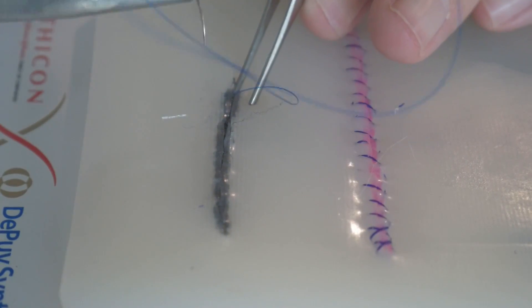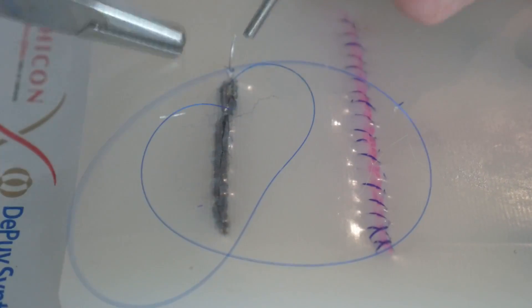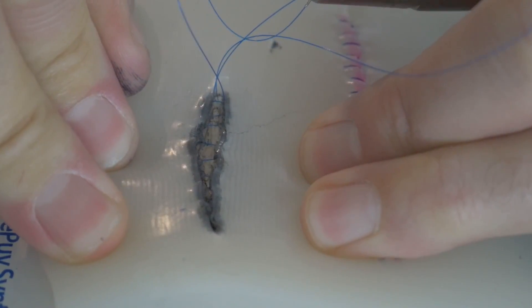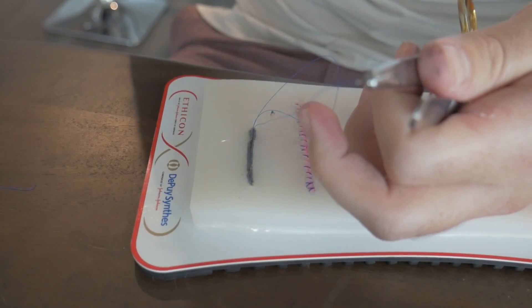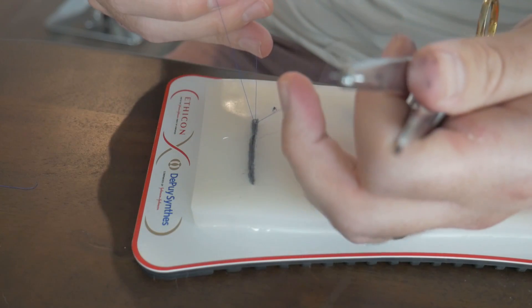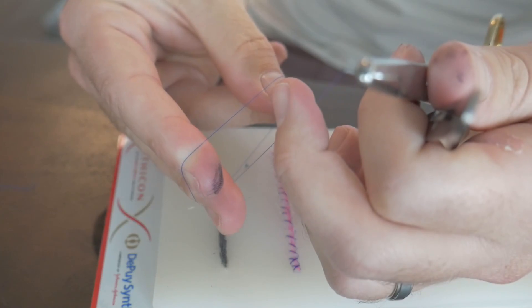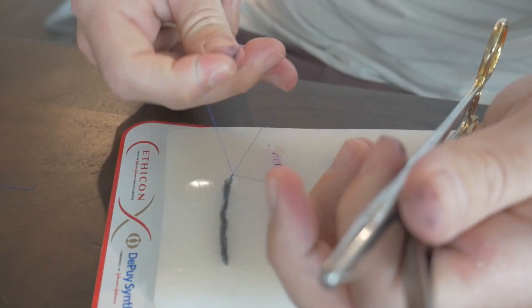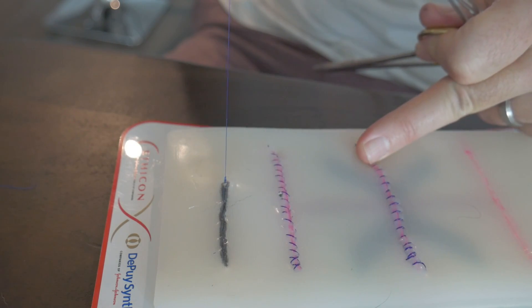Now for the last two stitches here, I'm close to the opposing apex of the incision here. And it's same thing. Deep to superficial, superficial to deep. Pull the incision apart. See that nice ladder, that lattice coming across the incision. It's going to close up really nicely. So I have a nice big loop on one side and my suture on the other. I'm just going to tighten it up a little bit and then pull this suture through three times.